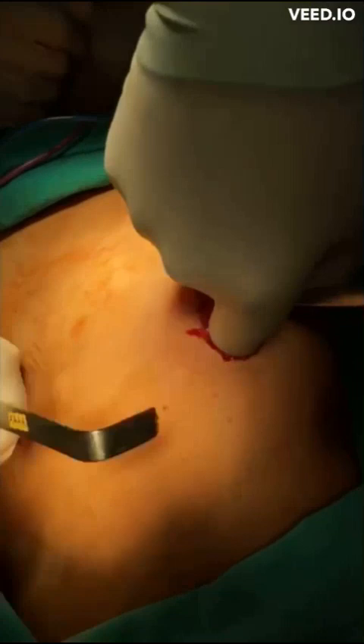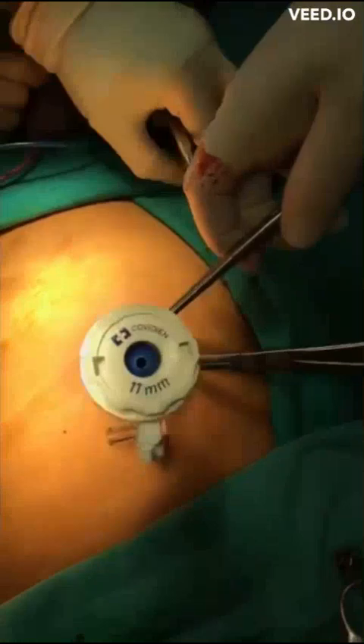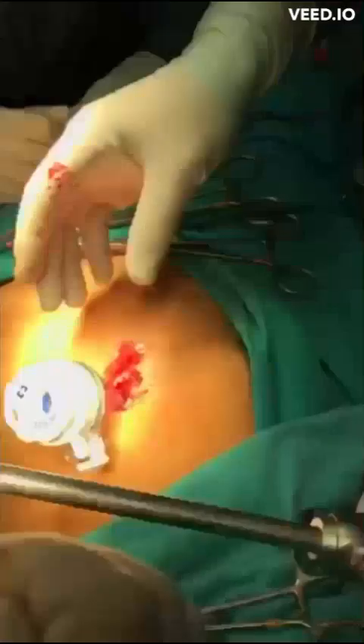Finally, an 11-millimeter incision giving a 30 to 45 degree angle to the teres ligament is made between the Kocher clamps, and the central 11-millimeter trocar is inserted into the abdominal cavity without an inner tube through the incision.